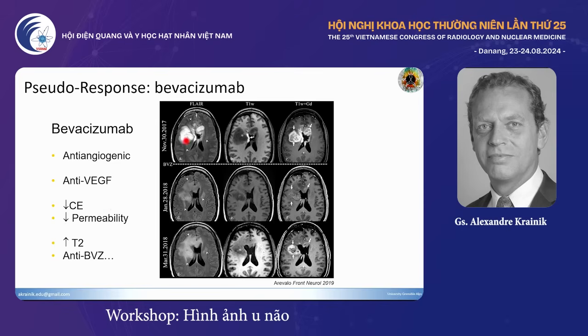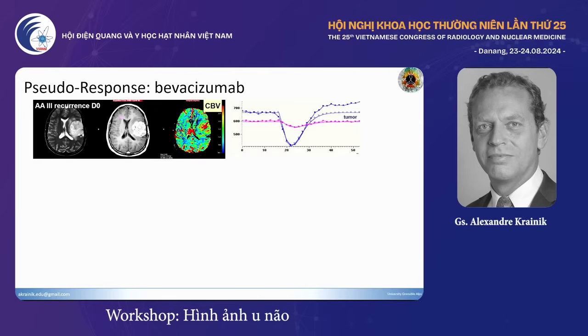Here's the first examination. You see, you give the treatment, you have almost a disappearance of the contrast enhancement after 2 months, and after 3 months, you see, it starts again. Then it's not a real response, it's called a pseudo-response.